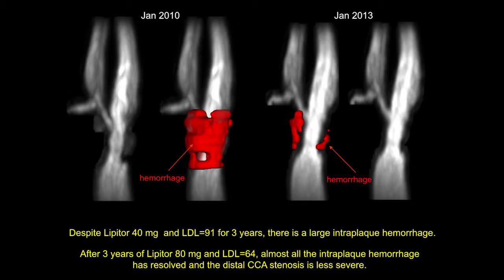And we believe, and now this is what I need to prove in a large multi-institution study, that this patient is going to be at less risk with his intraplaque hemorrhage going down than he would have been if we just continued to let the plaque hemorrhage grow. And so this, I think, is another powerful tool for vessel wall imaging.